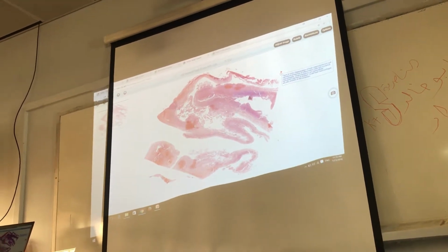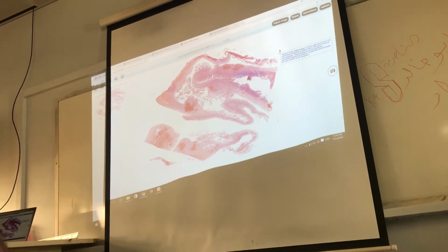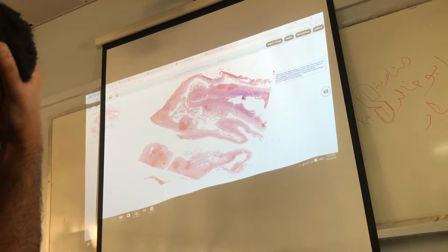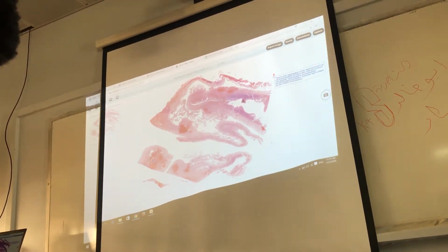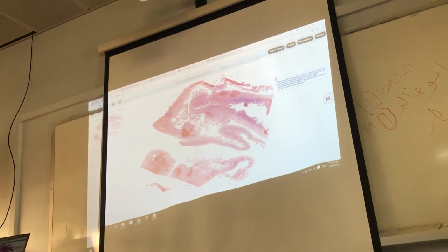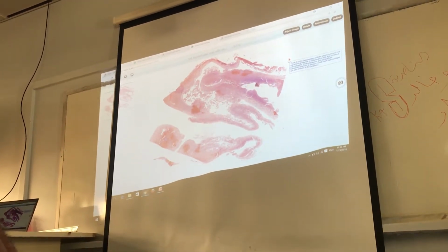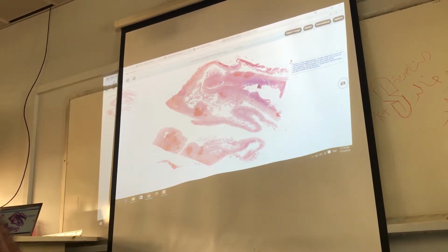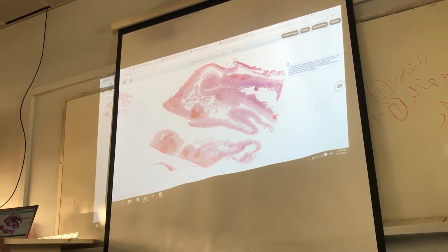Wear and tear phenomenon also, Doctor. Yes. One of that could be lipofuscin. So we actually use special stains to demonstrate it. This yellow brown pigment could be melanin, could be hemosiderin, could be something else like lipofuscin. So we differentiate with the special stain. So here are recent hemorrhages and remote hemorrhages. Remote, like the remote control you have for your TV.